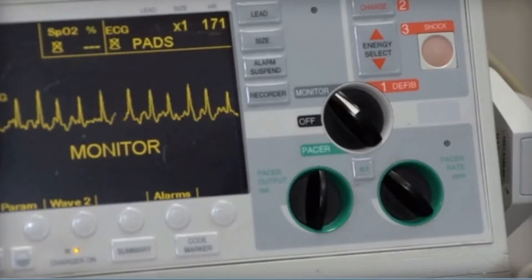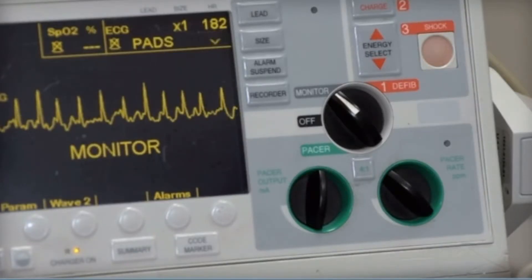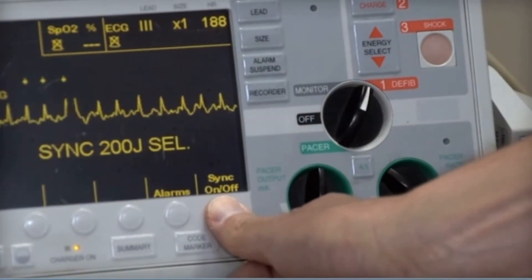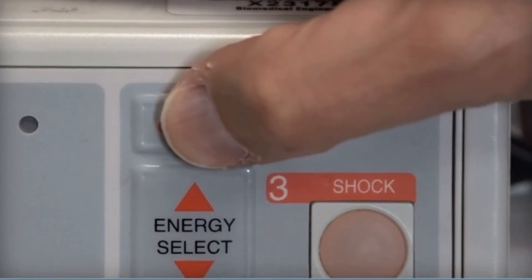In synchronized cardioversion, the defibrillator is synchronized with the QRS complex so that a shock cannot be given during cardiac repolarization, which can trigger ventricular fibrillation.